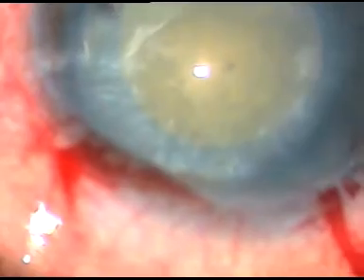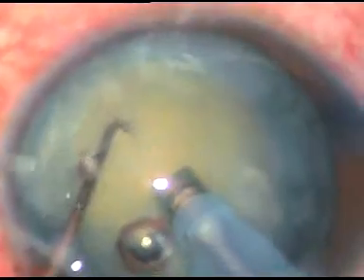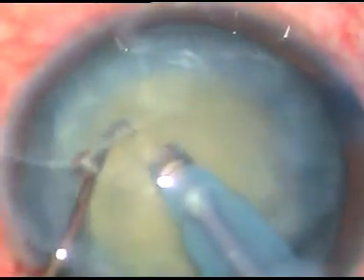Viscoelastic substance has been injected again, and now I go into the anterior chamber with the tip of the phaco handpiece. The titanium tip is embedded into the nucleus, and this is the first chop, and we get a complete crack. This cataract is mature, but it is not very hard. It is rather quite soft.